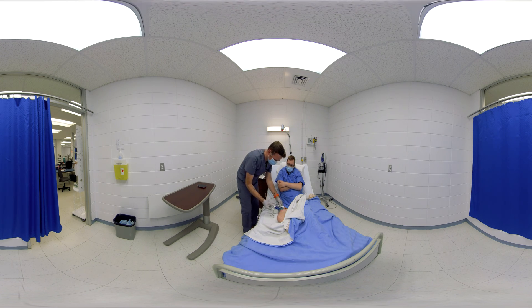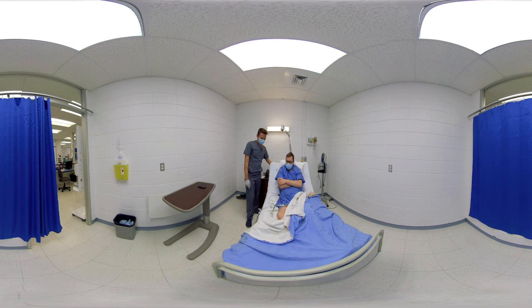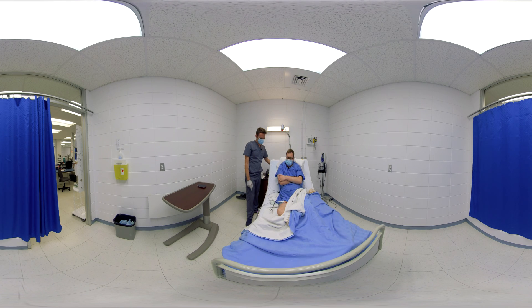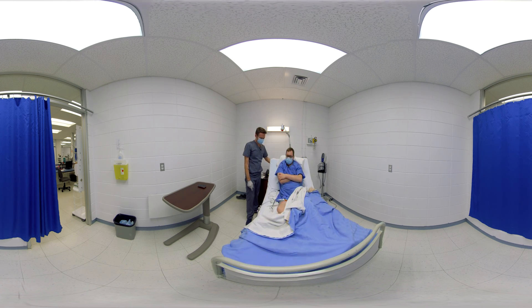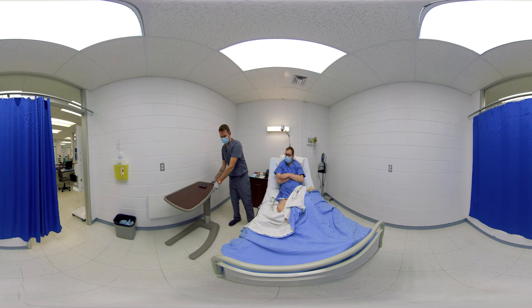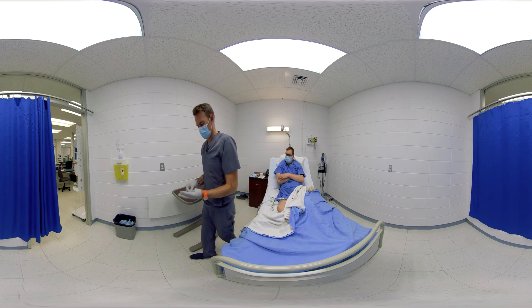The nurse adjusts the bed level so that he can work without risking a back injury. The nurse must disinfect the sampling ring to prevent contamination of the sample from bacteria on the ring, which would lead to false analysis results. Letting the alcohol dry for at least 30 seconds is required for the aseptic effect to work.